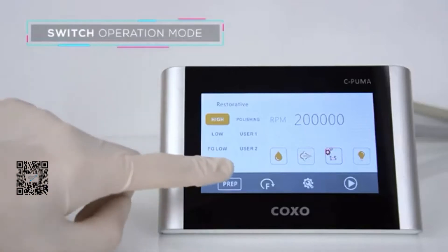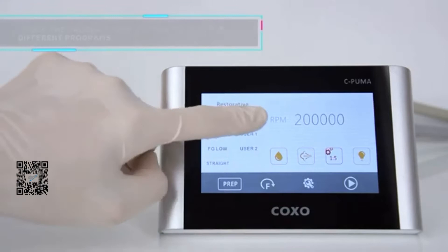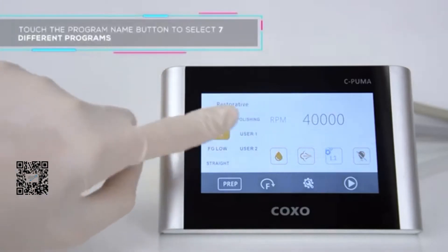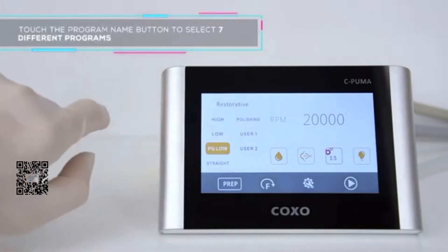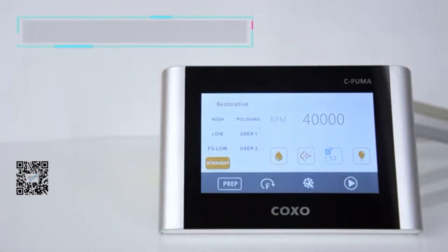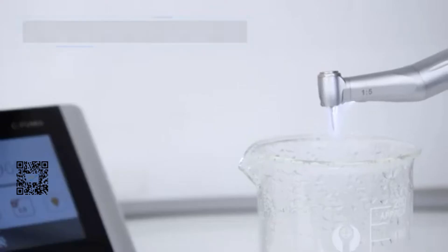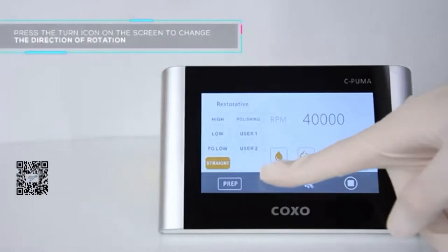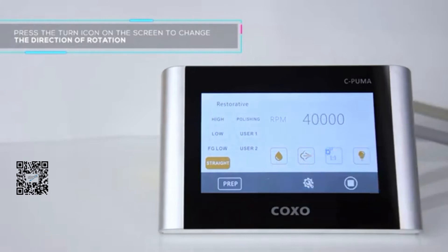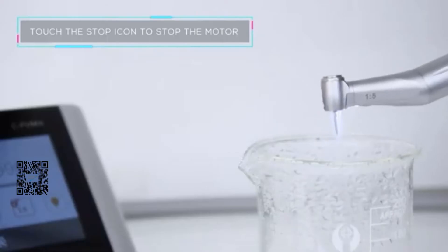Switch operation mode. Touch the program button to select from 7 different programs. Long press the start button to start the motor. Press the turn icon on the screen to change the direction of rotation. Touch the stop icon to stop the motor.